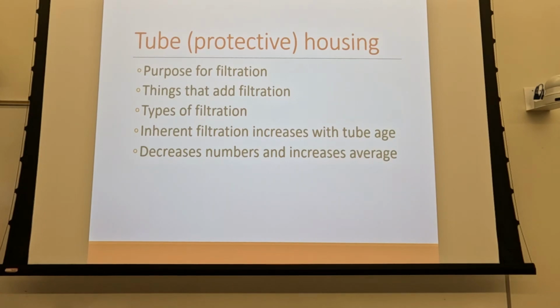But you can't expose somebody with just the envelope, right? You have to have 2.5 millimeters of aluminum equivalent. So the envelope, the oil, the port, the back of the mirror, all of that goes into inherent filtration. And for our purposes, inherent filtration is everything that gets us to 2.5 millimeters of aluminum, so we can legally make an X-ray.